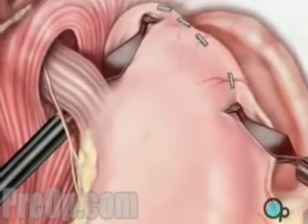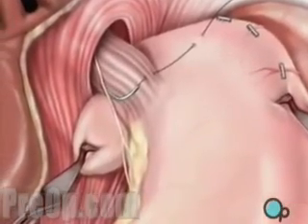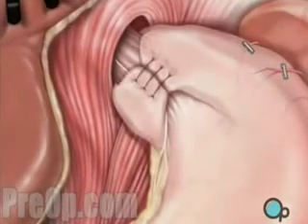Your doctor wraps the upper portion of the stomach around the esophagus and sutures it into place. A rubber tube is placed in the esophagus to keep the wrap from becoming too tight.